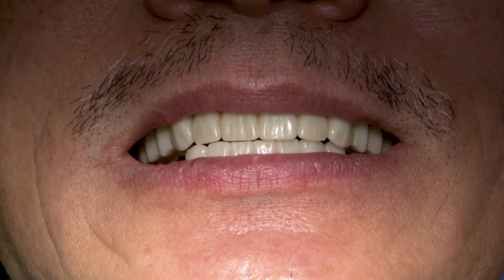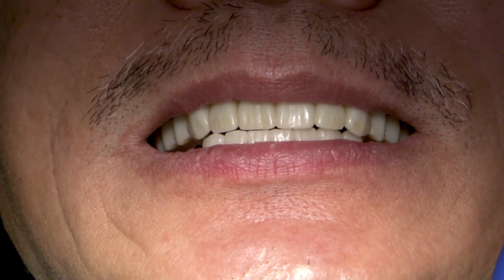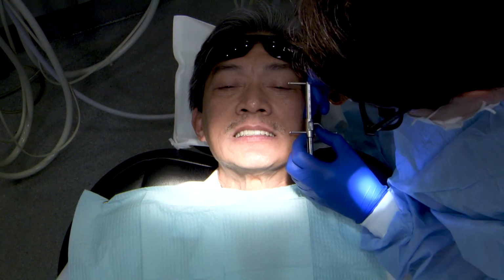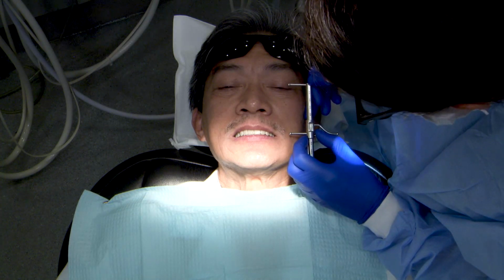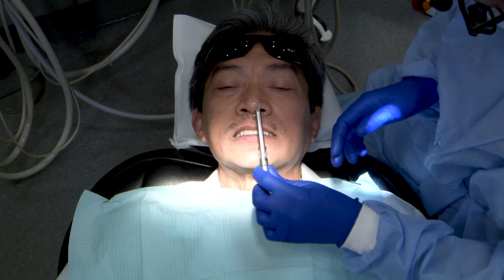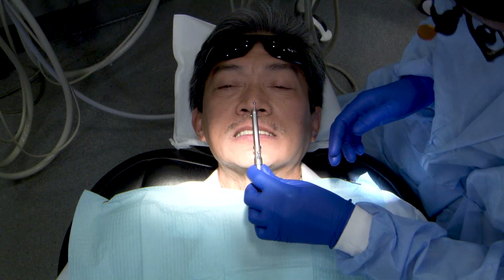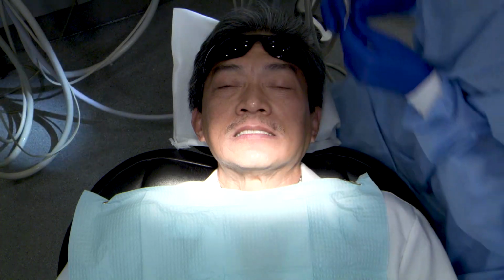Once the remaining teeth are no longer causing an interference and are in the correct position, I'm going to recheck my vertical dimension. Here you can see I'm using a VDO gauge, which helps evaluate the patient's facial thirds based on aesthetics. Since he has a comfortable and aesthetic current denture setup, I am making sure that this vertical dimension of the wax setup is similar to that of the vertical dimension with the prostheses in place.